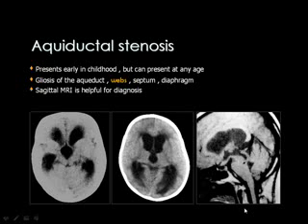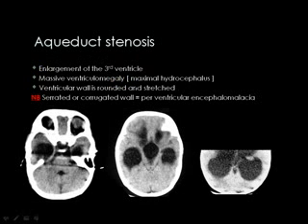And some of the books say that you can, in the sagittal image, see the region of the aqueduct, and you can see the congenital stenosis or the congenital web in the aqueduct, which is responsible for the supratentorial hydrocephalic changes. But actually in the CT and most of the MRIs, you can only see ballooning of the third ventricle, dilatation of both lateral ventricles, and the normal sized fourth ventricle. Then you can diagnose the possibility of aqueductal stenosis.